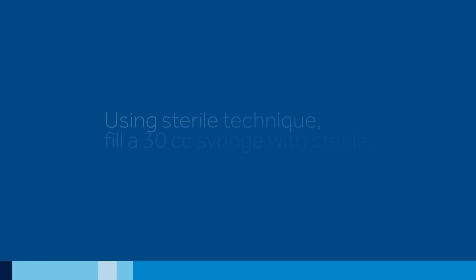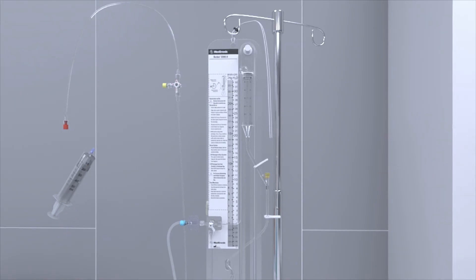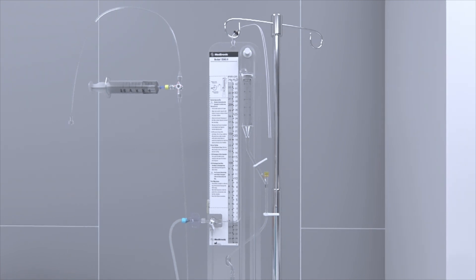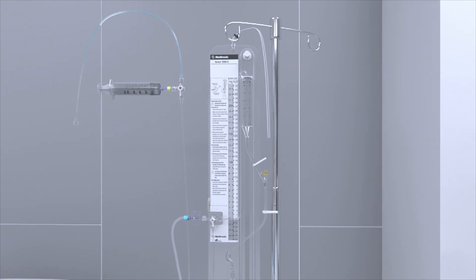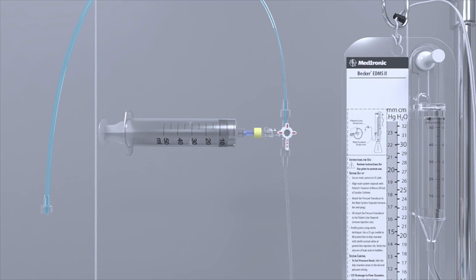Using sterile technique, fill a 30 cc syringe with sterile isotonic saline solution. Access the patient line stopcock sampling site and loosen or remove the red end cap on the proximal end of the patient line. Fill the patient line towards the short section of tubing that connects to the ventricular catheter. Ensure the line is fully primed and all air bubbles are removed. Replace or re-tighten the end cap on the patient line.